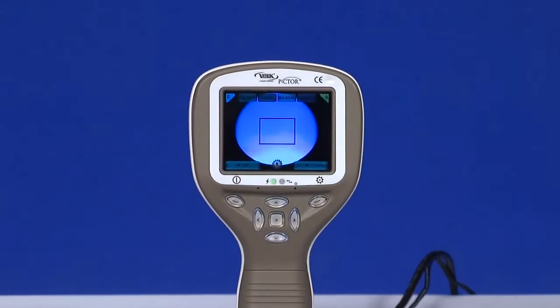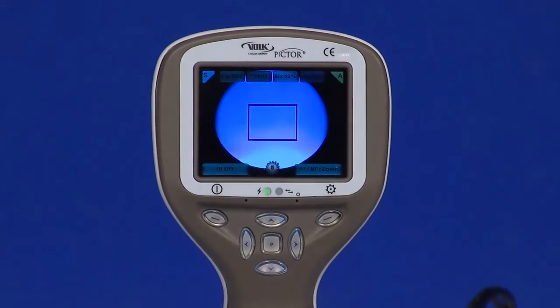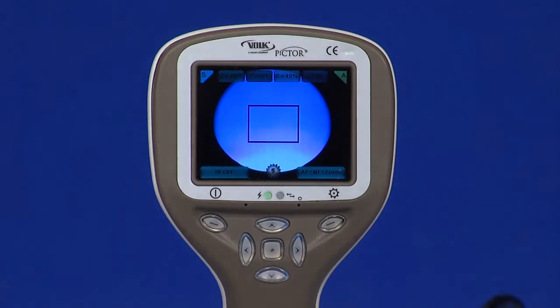The patient is asked to look at a target on a wall 6 to 9 feet behind the operator, or at the operator's ear.